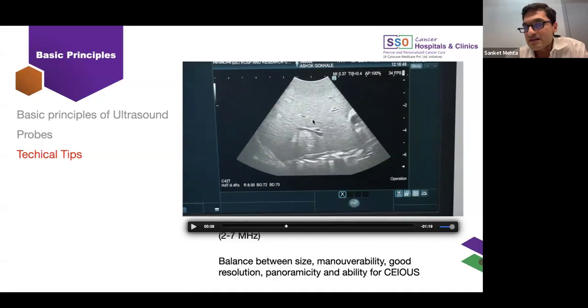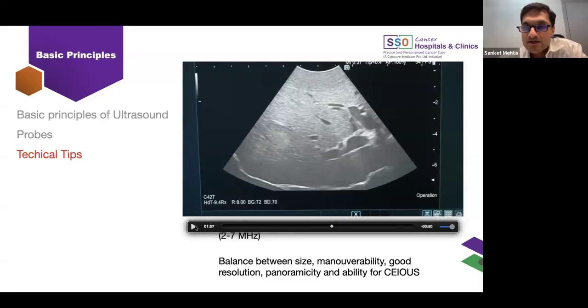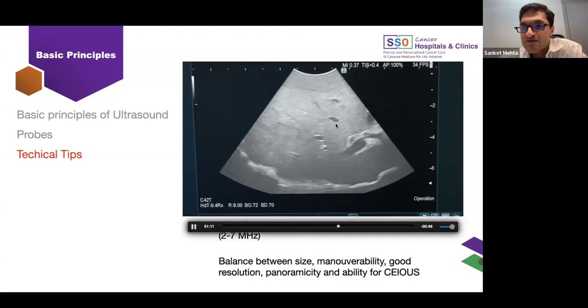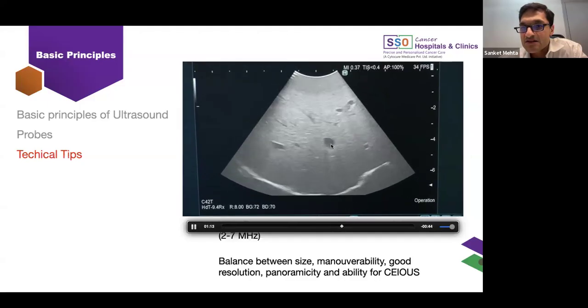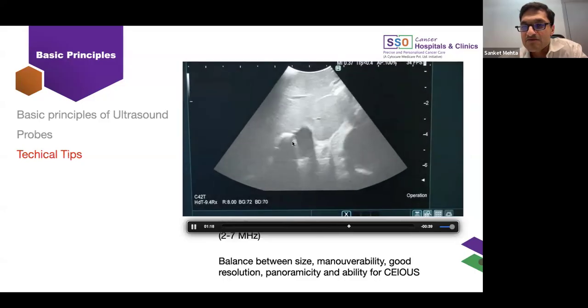Often you cannot identify the bile duct. Again, this is also a Glissonian pedicle. You can see the portal vein, and this is a subsegmental branch, which is the portal vein and the hepatic artery. Whereas if you see the vein, the vein is very thin walled like this. You can see this is the vein, and it is a single structure. There will be tributaries joining it, but it is a single structure and does not have a thick fibrous layer around.